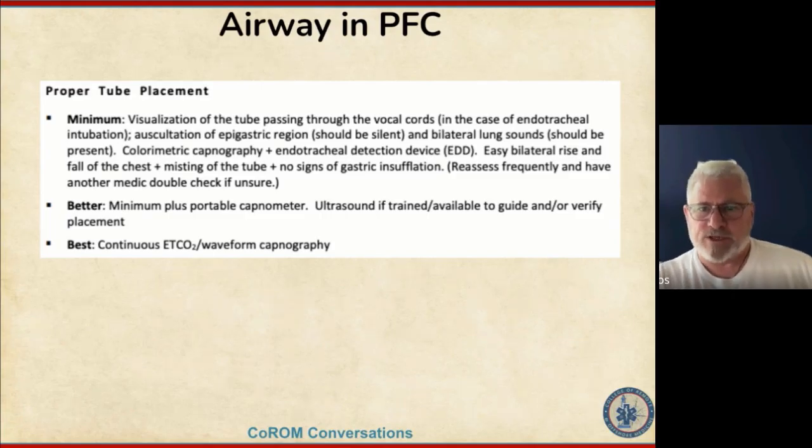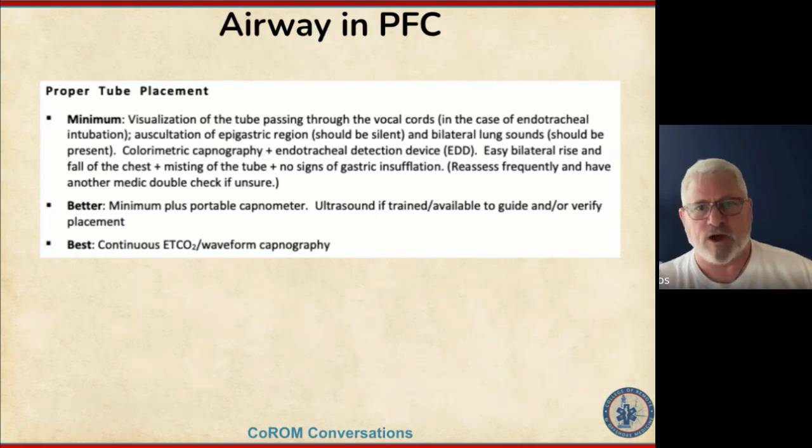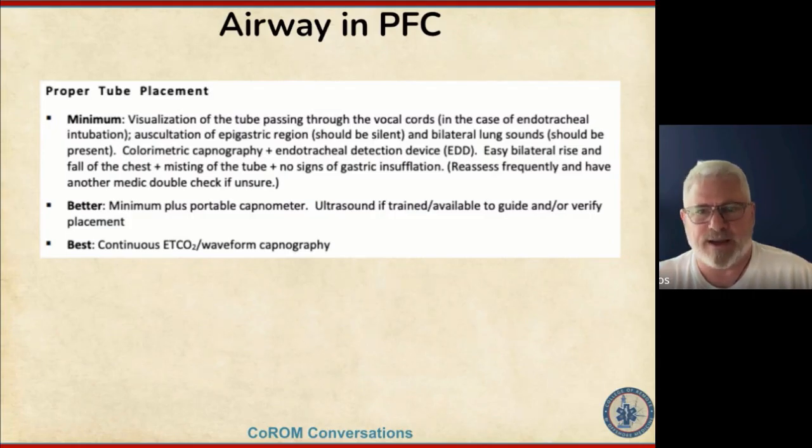But it's also another indication that you might be right main stemming it. If you have diminished sounds on the left and you hear them much louder on the right, that'll tell you that it's in the right main stem. And then you can look at the tube for a visual confirmation that it's probably too far advanced. And then you can retract the tube a little bit until you hear equal breath sounds. So developing a systematic way to assess confirmation of tube placement should start with the stomach, then the left lung, then the right lung.